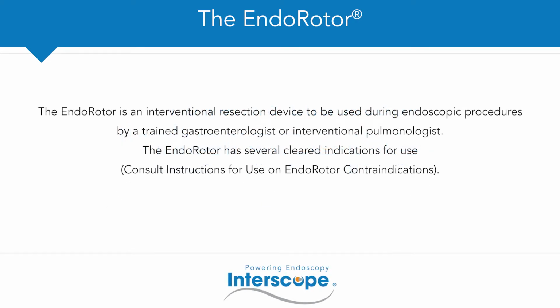The EndoRotor is an interventional resection device to be used during endoscopic procedures by a trained gastroenterologist or interventional pulmonologist. The EndoRotor has several cleared indications for use. Consult instructions for use on EndoRotor contraindications.